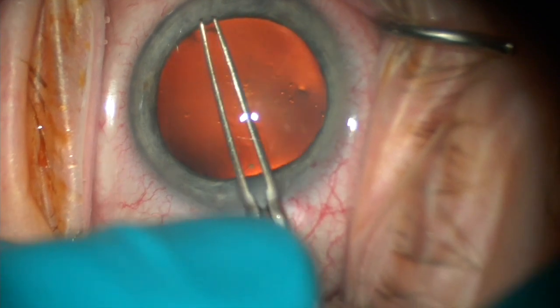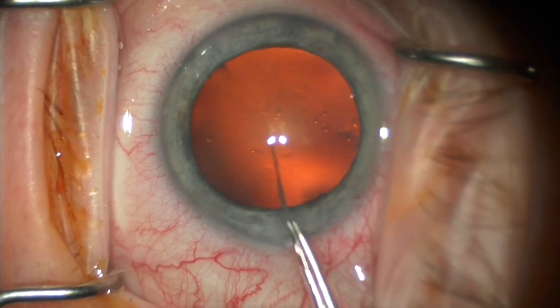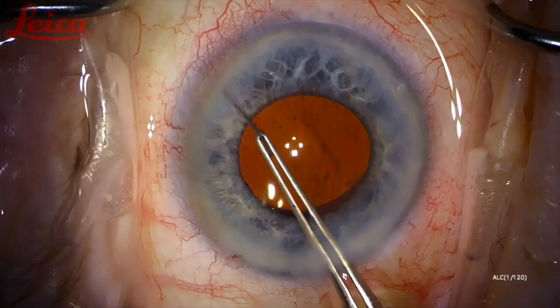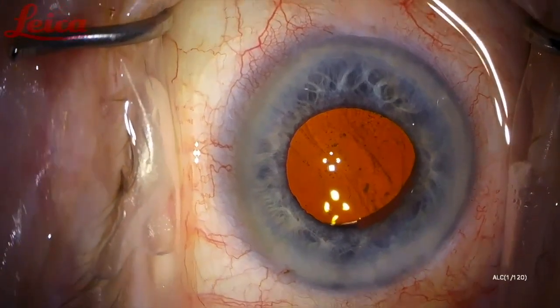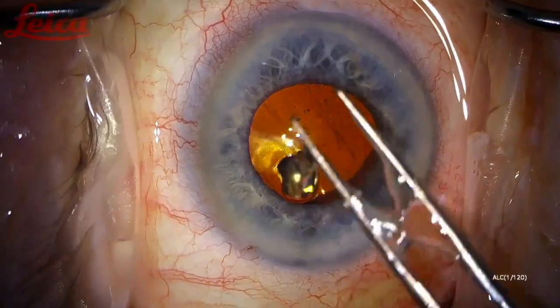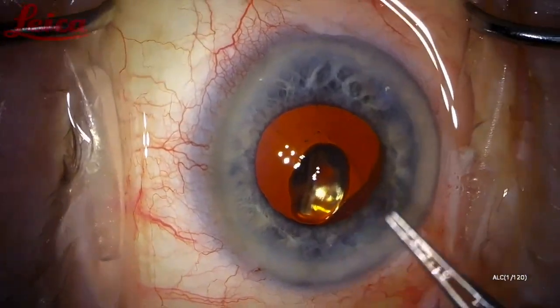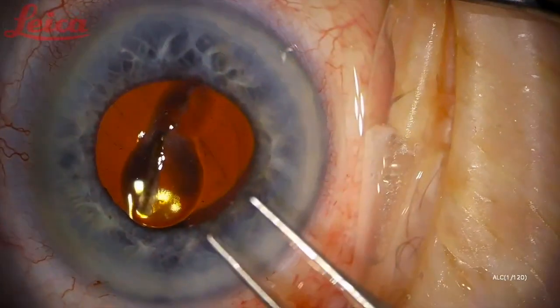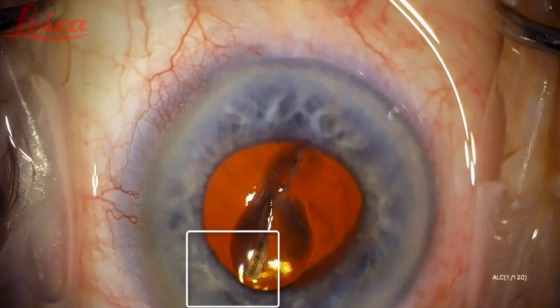Usually you will end up needing to remove a TM strip. My favorite way is just with the utrata forceps, as you can see here. This can be done safely pre-phaco with a viscoelastic fill, or you can wait till the end of the case with hydrated incisions or viscoelastic in the eye. As long as the chamber is stable, you should be able to grab it at the base and pull slowly. You're going to get these nice long TM strips that have both pigmented and non-pigmented TM — how cool.